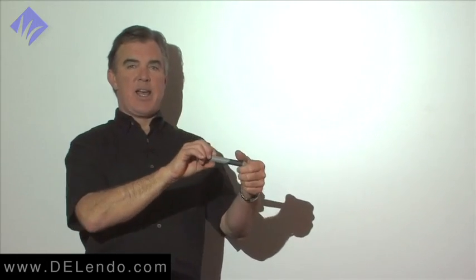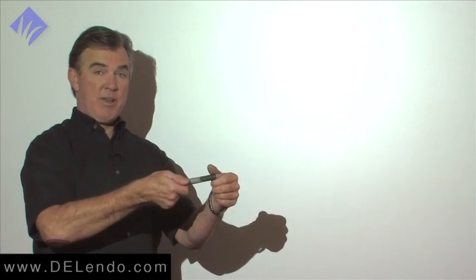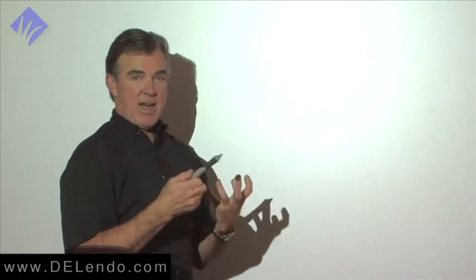Most of us want to apply pressure at the start and then we kind of let go as we rotate. You've got to hold that all the way to the end. So you apply the pressure, you turn it, turn it, turn it, and you feel a click, click, and you're done. Don't pull the file out, you just let it rock right back into the canal. I actually move my body back to remove the apical pressure. I reset my fingers, push on it, cut, rock in, push on it, cut, rock in, push on it, and cut. And you'll see my body actually moving. It's kind of goofy looking, but that's how I apply force through my torso and my arm and my hand.